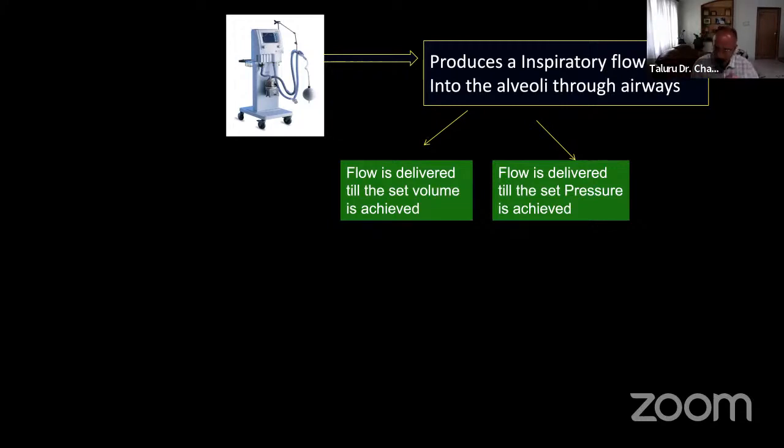So having said that, see, I have underscored 2 points here. What you have to understand is, there is an inherent delay in all the conventional basic modes we use. And second thing is, we don't have a means to estimate neural inspiratory and neural expiratory time. So inherently, there is some dysynchrony that can happen, but in most normal healthy patients, dysynchrony doesn't happen. So coming to what a ventilator does.